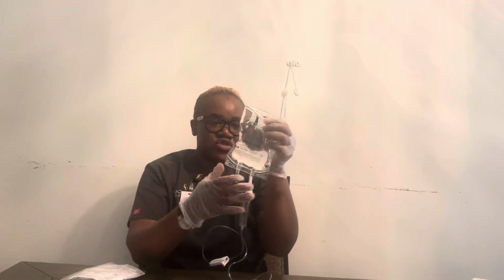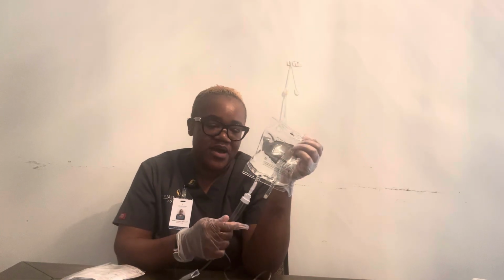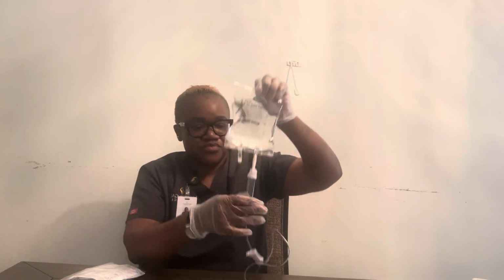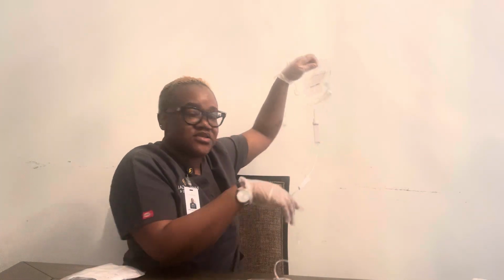Okay, so since I know that I'm going to be doing a piggyback, then I am going to hang this up. I'm going to hang this on the lower.